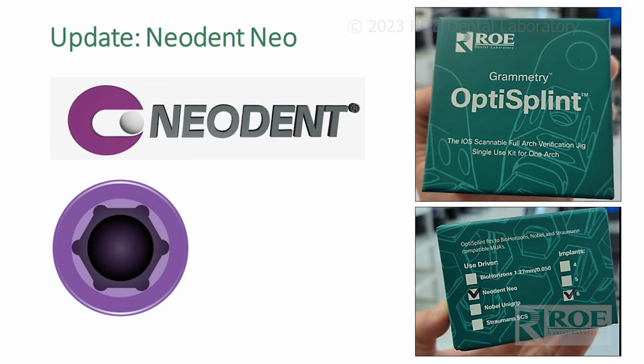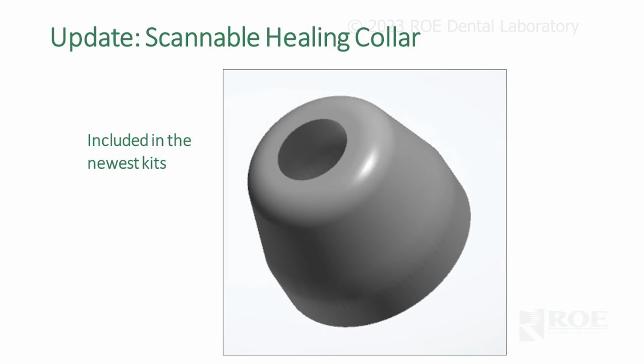See right here, MIS is not on here. They just brought it back. Okay, but the OptiSplint itself is the same. All right, very important. It's also critical that you use their screw. We'll talk about that. I got a slide on that. So they also are now including a healing collar in their kit. So if you want to use their healing collar instead of other ones out there, theirs is very nice. They're very smart people, and they designed one with the right color and the right design so that it's easy to scan. So that's a nice update.